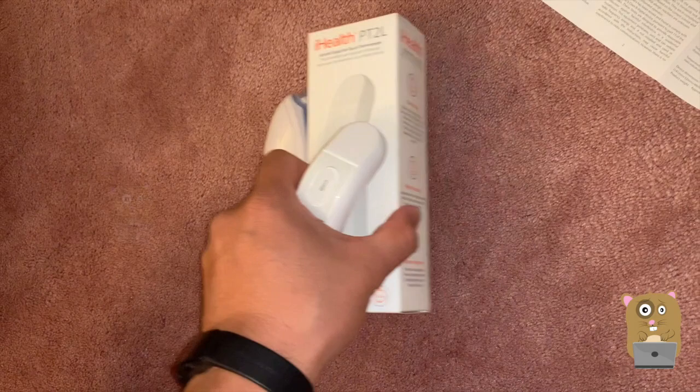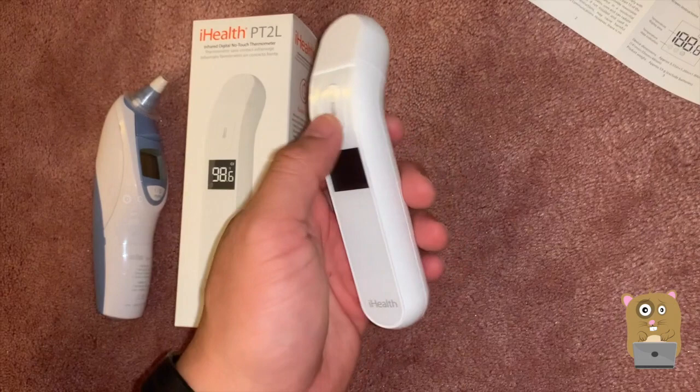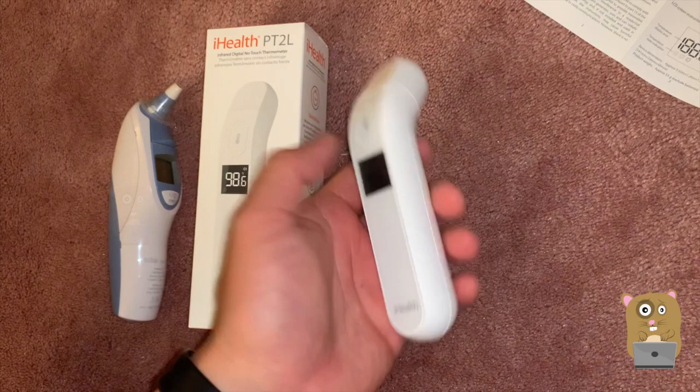The non-touch thermometers have their uses. When the child is sleeping and I want to take the temperature, I'll be using this. At the ball games where we measure every child's temperature before they play, it would be this.